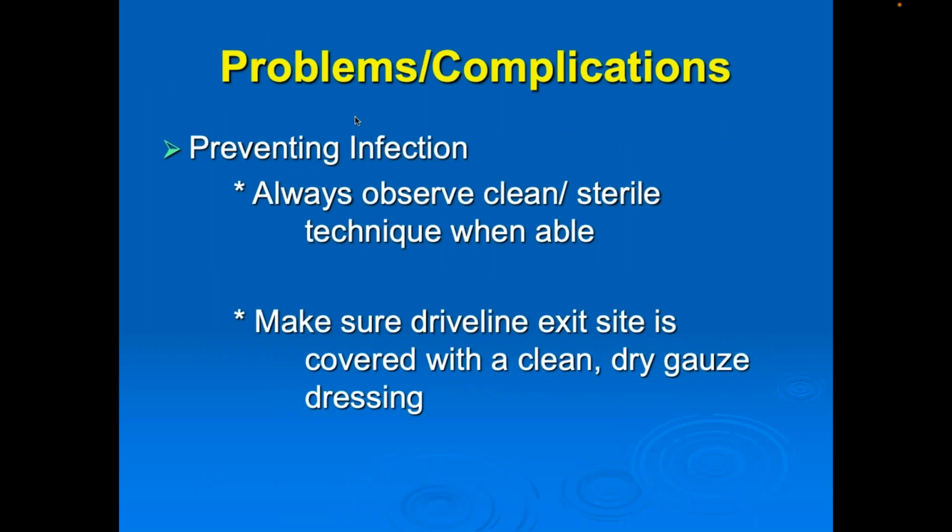Problems and complications: preventing infection. Always observe clean, sterile technique when you're able to, and make sure the driveline exit site is covered with a clean, dry gauze dressing.